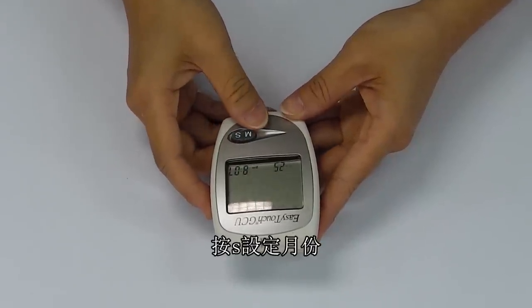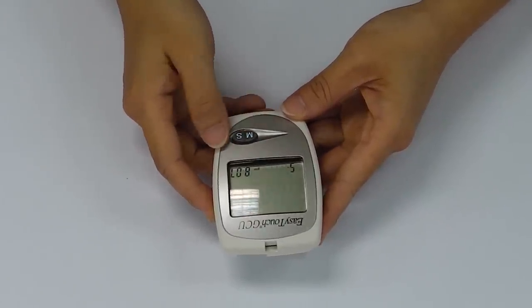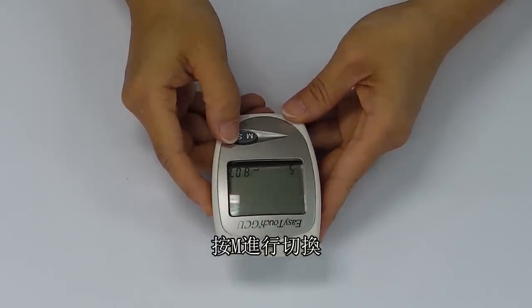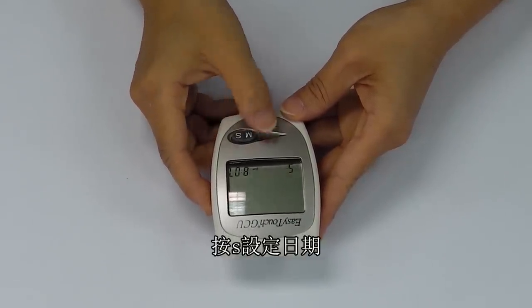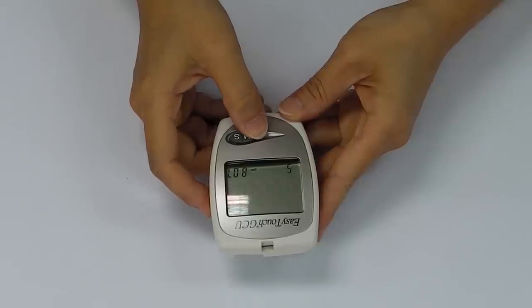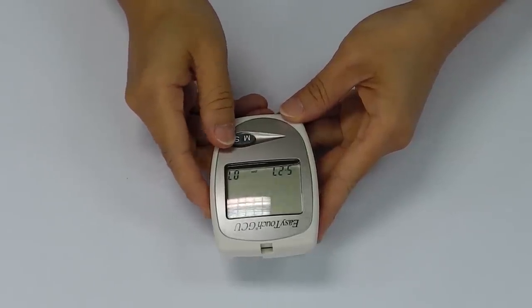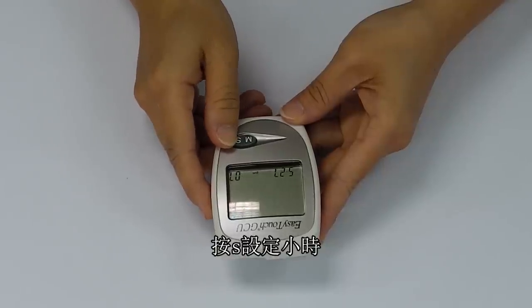Press S to change the month. Press M to shift to the date setting. Press S to change the date. Press M to shift to the hour. Press S to set the hour.